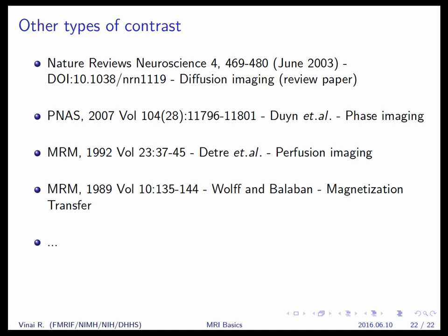The thing is, with BOLD experiments, you're actually looking at how the signal behaves over time. So if your subject is relatively stable in the scanner, a particular voxel may have low signal, but over the course of the experiment it should always have low signal. It should only go up and down in areas closer to where there is activity, where you're looking for activity.